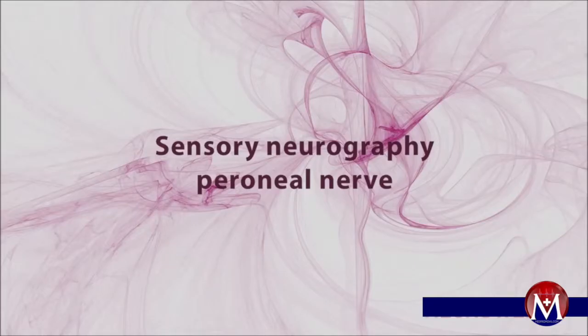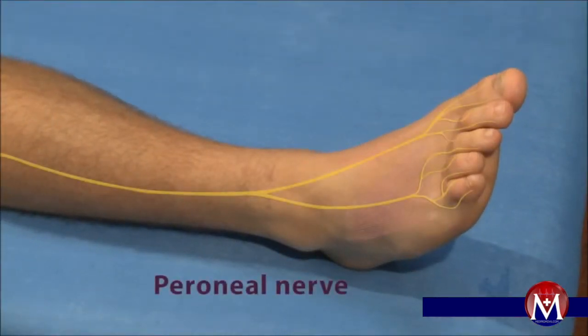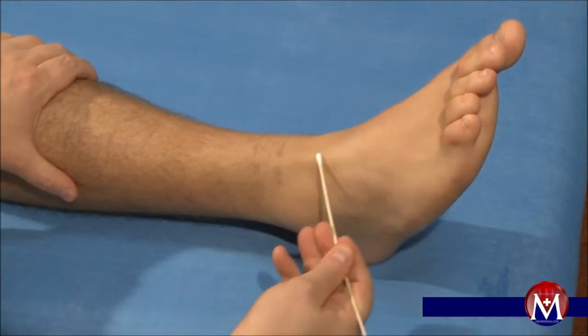Sensory neurography of the peroneal nerve. The measurement of the sensory nerve conduction velocity on the peroneal nerve is shown here in the form of the antidromic technique. Taking a recording via the orthodromic technique is also possible.